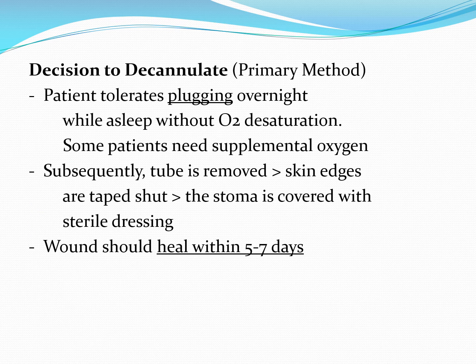The decision to decannulate is a collective decision, obviously driven by the patient and the physicians. If the patient tolerates plugging overnight, and we're not talking about mucus plugging, we're talking about capping, while they're asleep, monitoring their O2 saturation, they don't have any issues with that. If they do have minor desaturations, provide them with some supplemental oxygen.